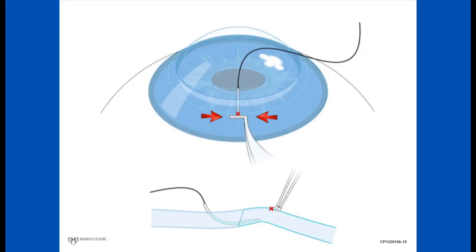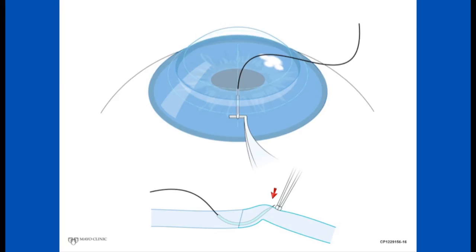Note that the colibri is also positioned about a millimeter from the host edge. Press down and actually cornea the needle instead of needling the cornea.